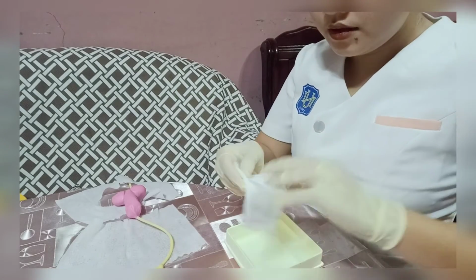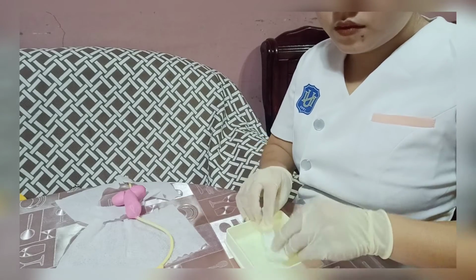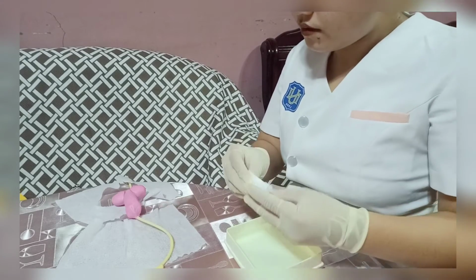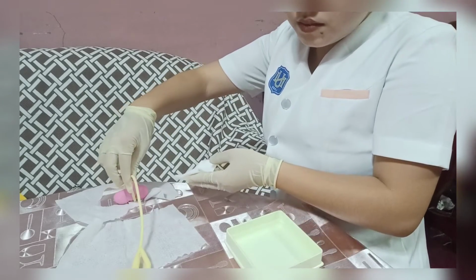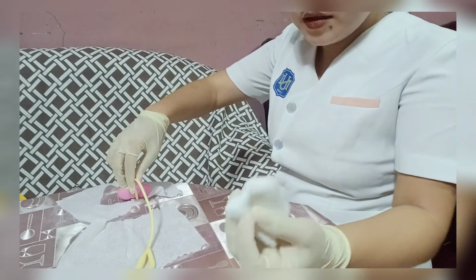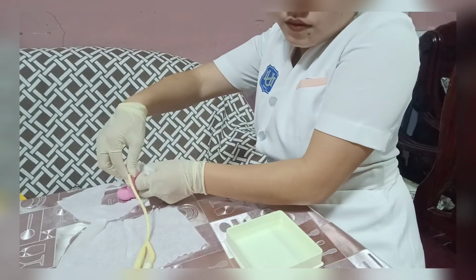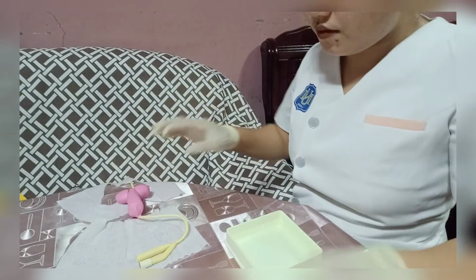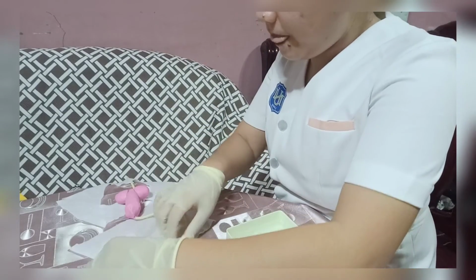Then repeat with a clean cloth, cleaning the penis well and the other side. Then we also have to pat dry our male patient.